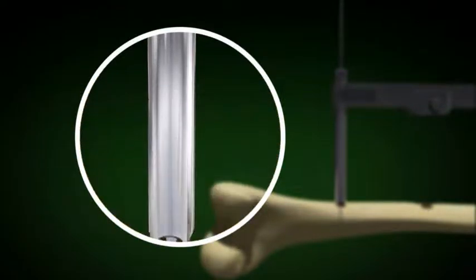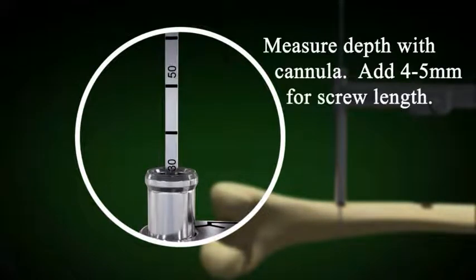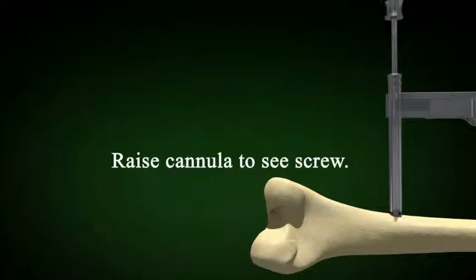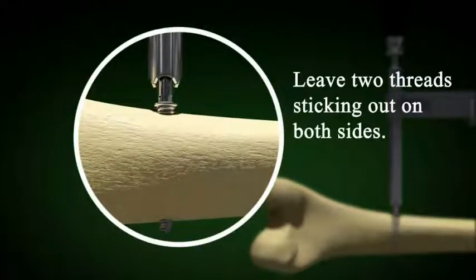Add 5 millimeters of screw length to the measurement on the cannula. This extra 5 millimeters of screw length will be used for stability of the screw, as well as if the screw needs to be removed. Leave 2 threads sticking out on the far cortex and 2 threads sticking out on the near cortex.